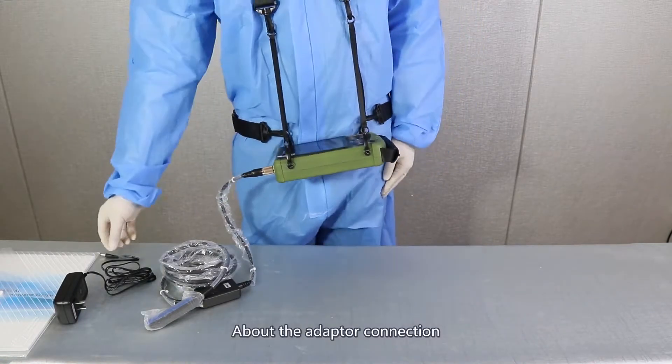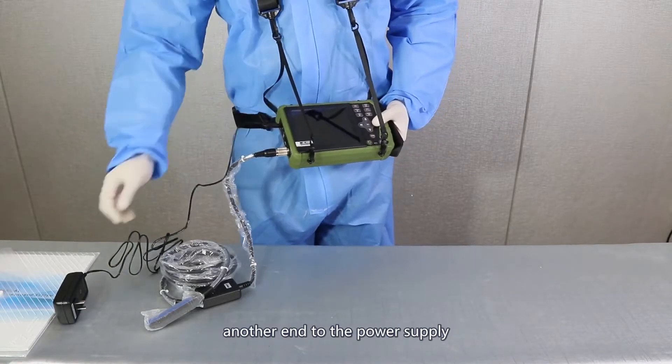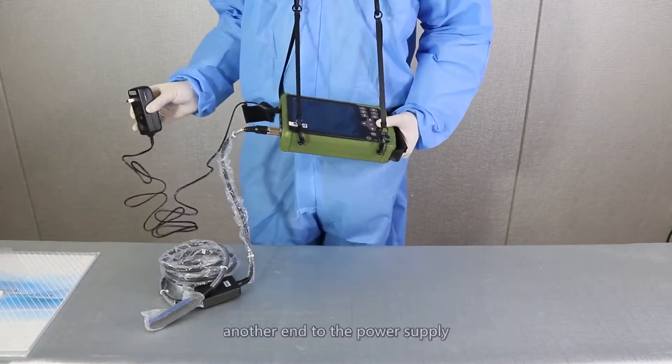About the adapter connection, please plug one end into the charger interface and the other end into the power supply.